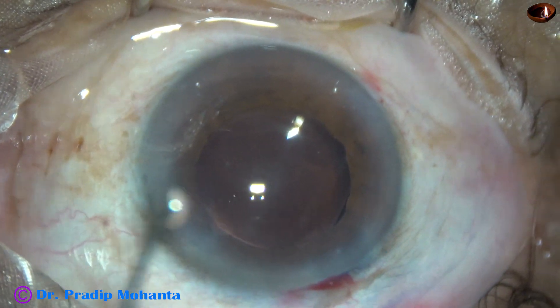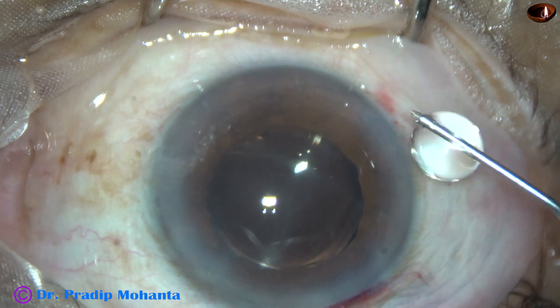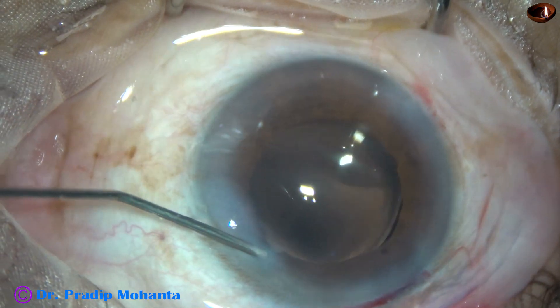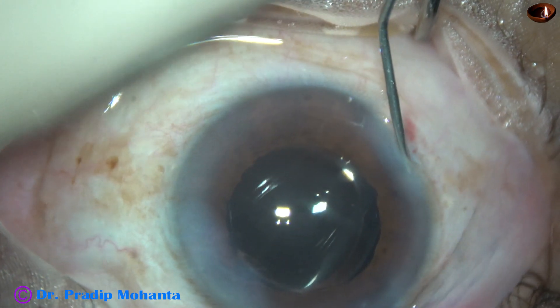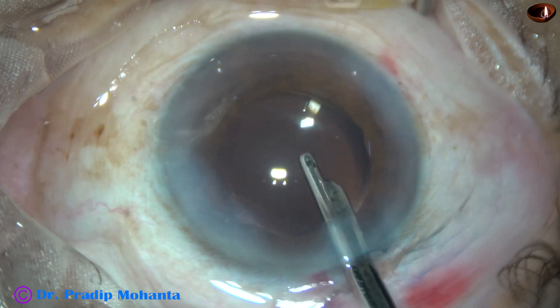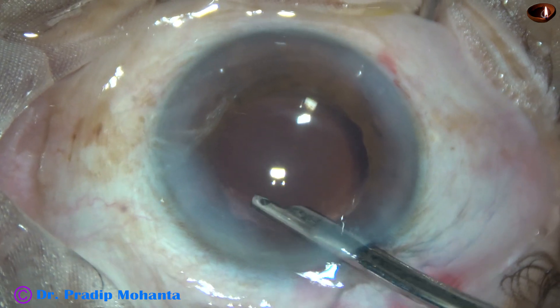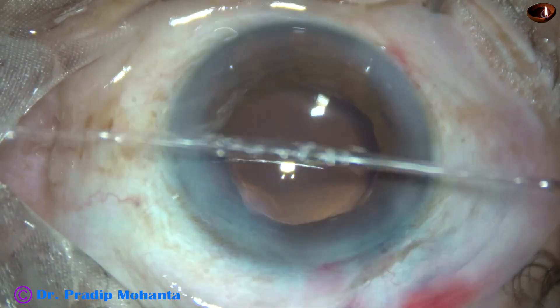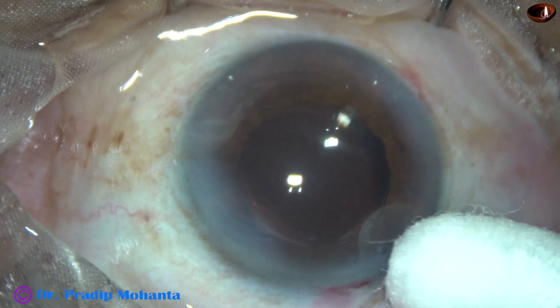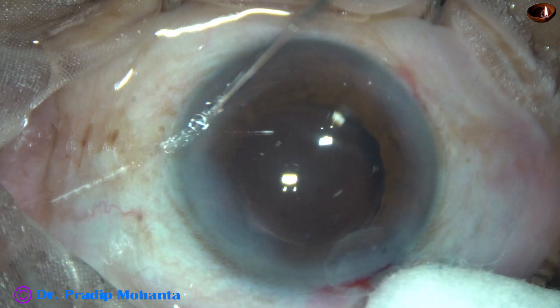The side ports are closed by hydrating the corneal stroma. Before that, this is a bit of moxifloxacin. The corneal stroma on either side of the side ports is hydrated to close these stab incisions. And now this is the final lavage of the anterior chamber. The anterior chamber is nicely formed keeping the Simcoe at the main wound. There is no leakage of any fluid from the main wound. After checking the integrity of the wounds, a few drops of moxifloxacin is applied over the ocular surface and the case is concluded.